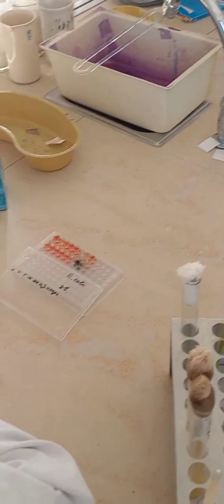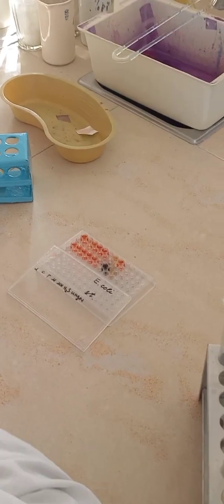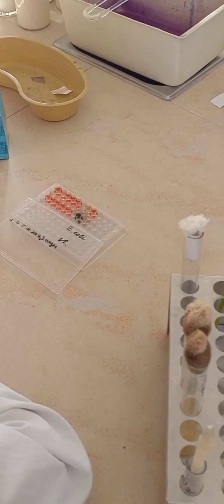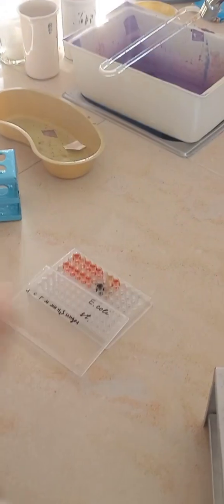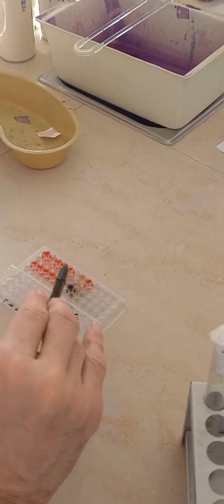My also standard question. Which color attracts your attention most of all? Black, of course. Without inventing something extraordinary, it will be black. Who remembers? That's why I all the time ask you to pay attention to black, because it's associated only with one reaction. What is hydrogen sulfide? So it means the neighboring well also should be devoted to proteolytic activity. That's why you see even separation into one well.